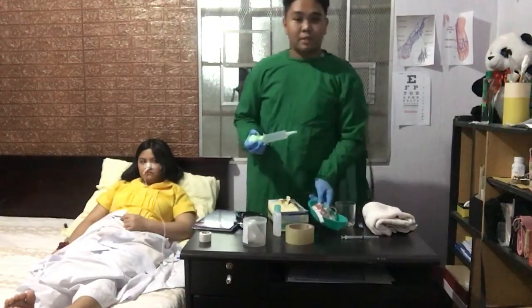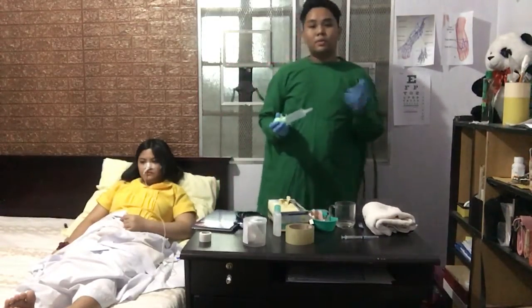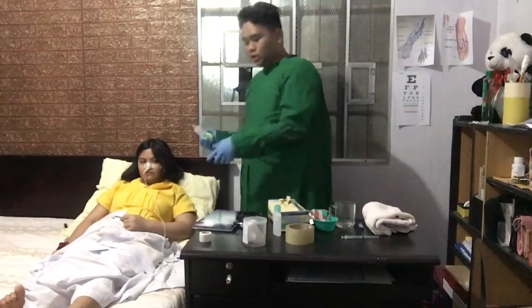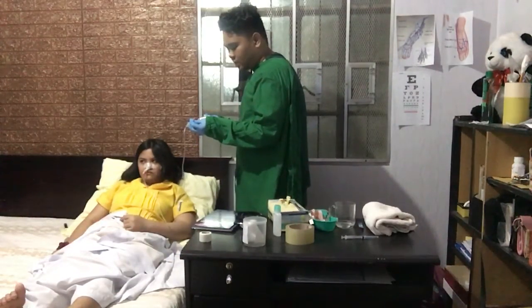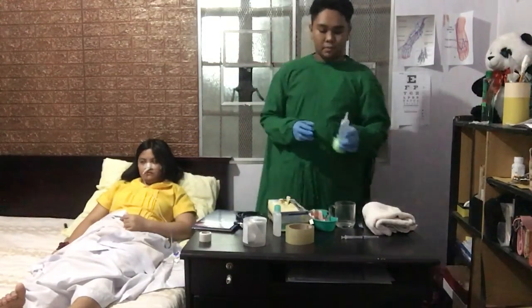Ilalagay po natin for example dito to check the residual amount. Then, we return the residual amount to the end of the tube, as indicated by the medical record.